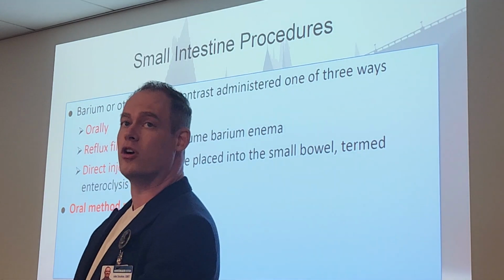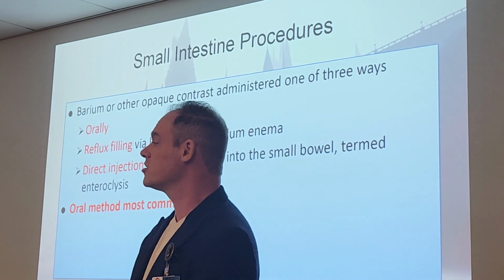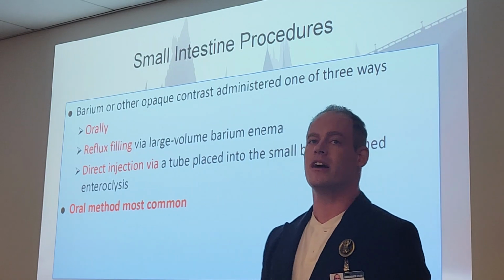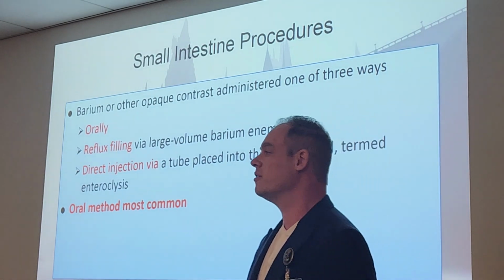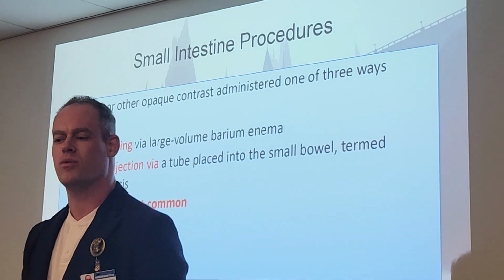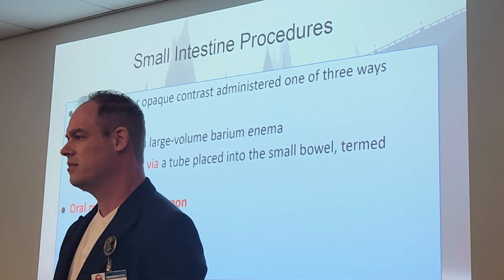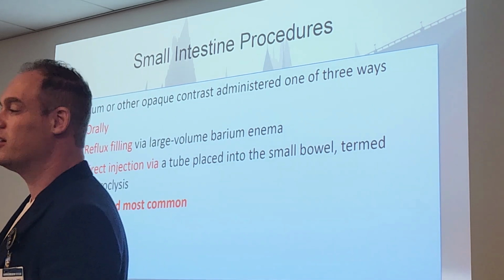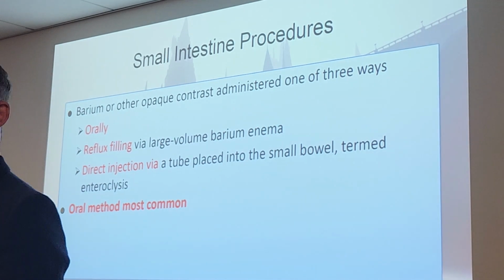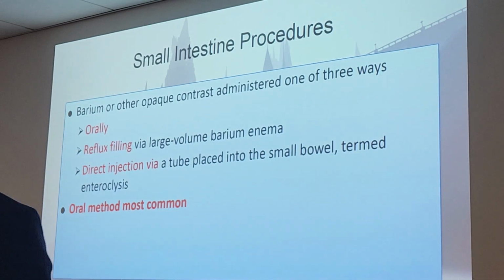Okay, so barium or other opaque contrast is going to be administered one of 3 ways for our small bowel follow-throughs: either orally, drinking the solution; reflux filling via a large volume barium enema, which would be a very uncomfortable way to have that done, because you're just shooting it all up the rear, going backwards; or direct injection via tube placed into the small bowel that we call enteroclysis.